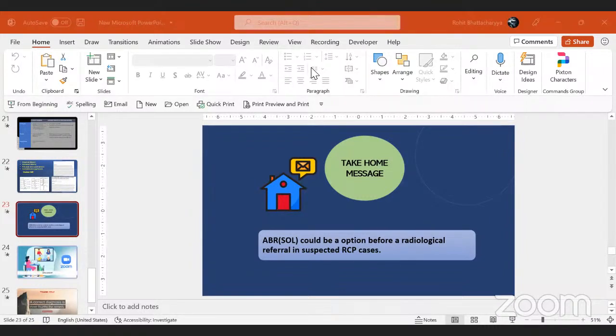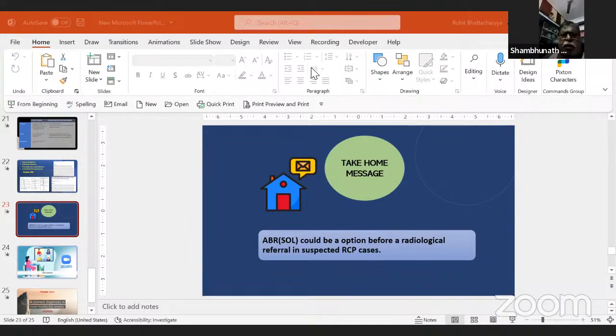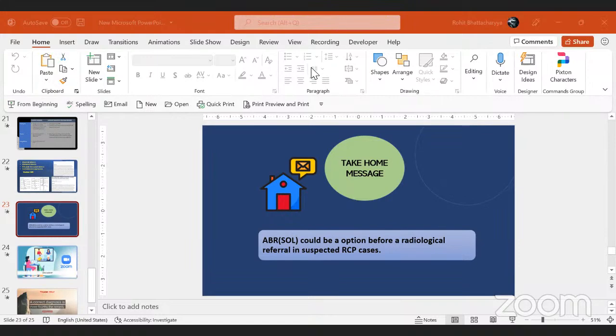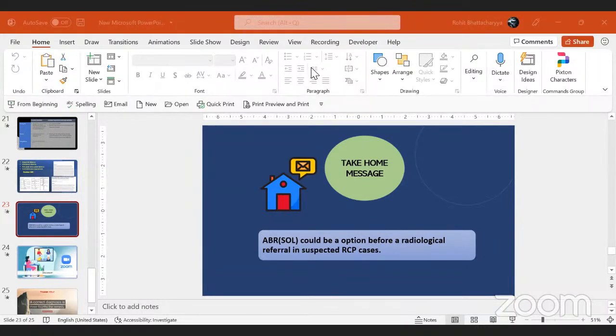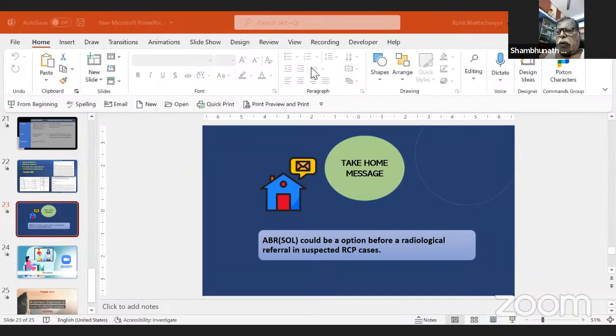In case of the ABLB test, sir, are you asking? Yes. Sir, in case of RCP, the ABLB test we don't practically use so much because of the procedural and instructional difficulty. But again, sir, decruitment is an indication of retrocochlear pathology. So also the supra threshold reflex decay. This is also important. Yes, sir.